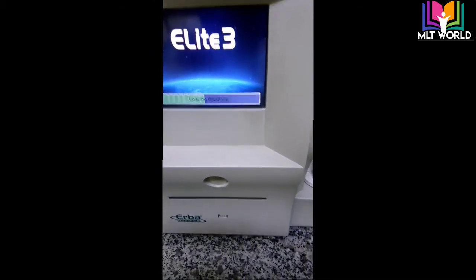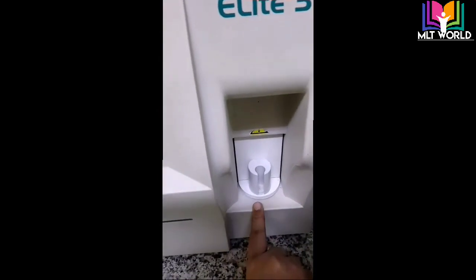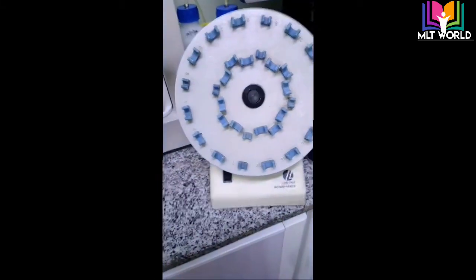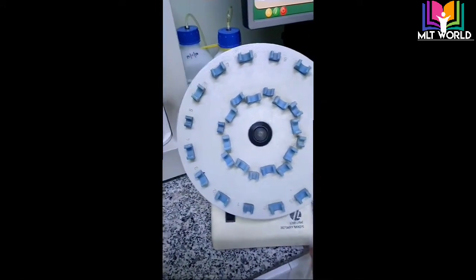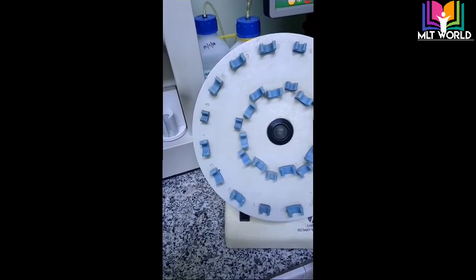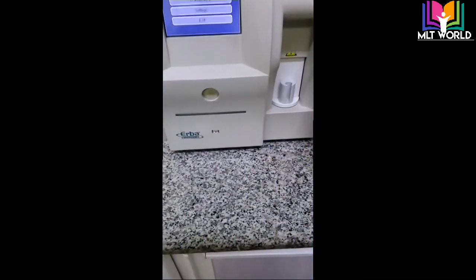After loading everything it will go to the main screen. This is the point where we keep our sample, and this is the mixing rotor for EDTA whole blood samples. You should keep the sample on the rotor for at least two minutes, or at least nine to ten circles, so that the sample is properly mixed with the anticoagulant.